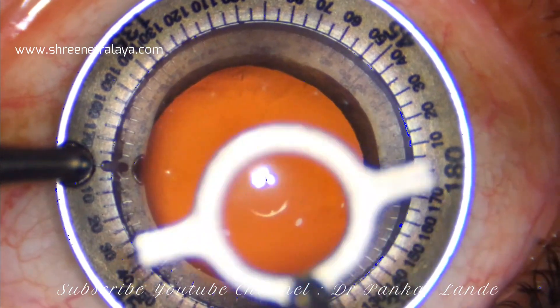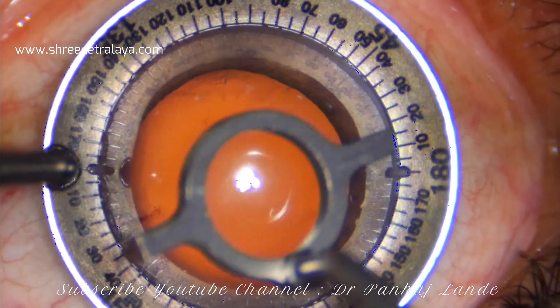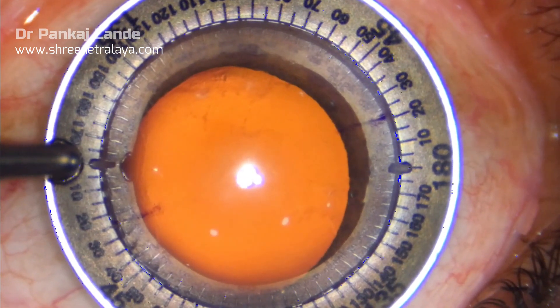The calculations for LRI can be performed on LRI calculators which are available online, or you can follow some nomograms like NAPA which are available on the net easily.